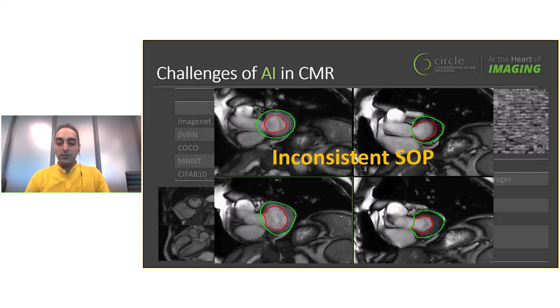Like, for example, how do we overcome concept drift? How do we prevent a potentially malicious user from feeding bad contours to the network? What happens when we start overfitting to the contours that they're feeding? And if we are able to take our learning approaches and implement them on site, what benefits does that afford us?